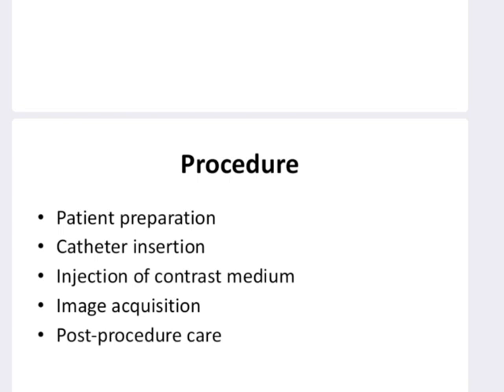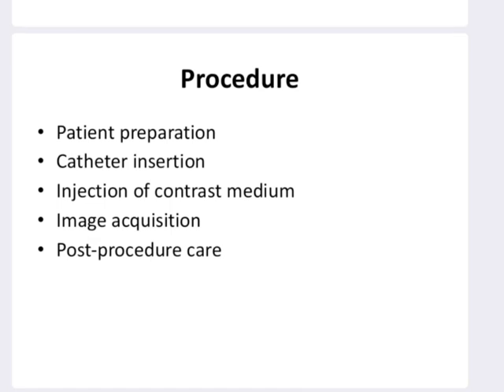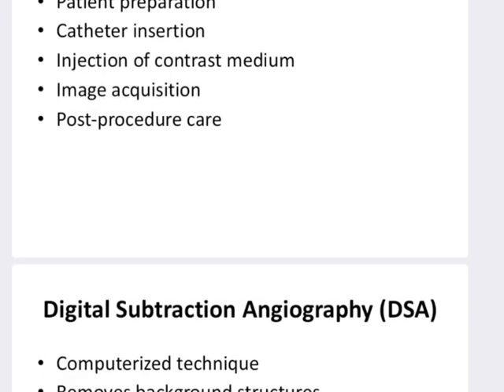And after this procedure completion, the catheter has to be removed properly and the puncture site must be cleaned and made such that no air or any other substance enters through those insertion sites, as this insertion site is frequent for causing any of the diseases.